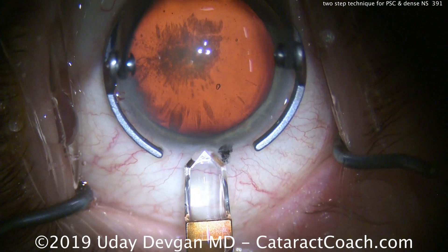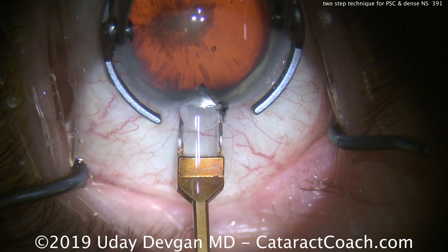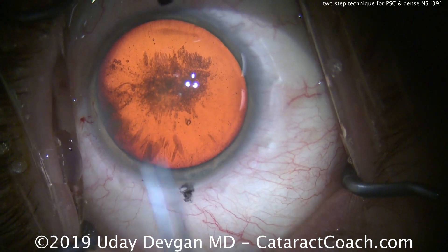We're going to make our main phaco incision here. The black mark is the 180-degree meridian and we're making this incision at about the 165-degree mark — that's where the patient's astigmatism is, the steep axis.